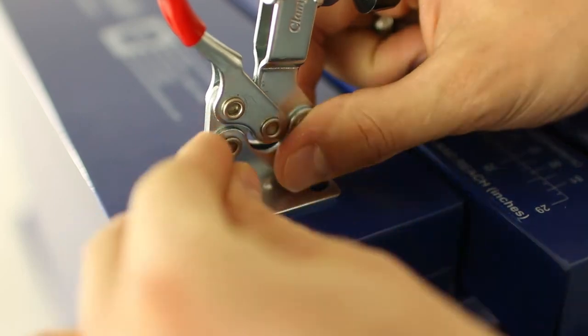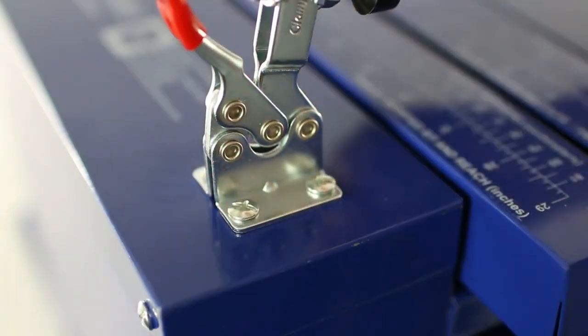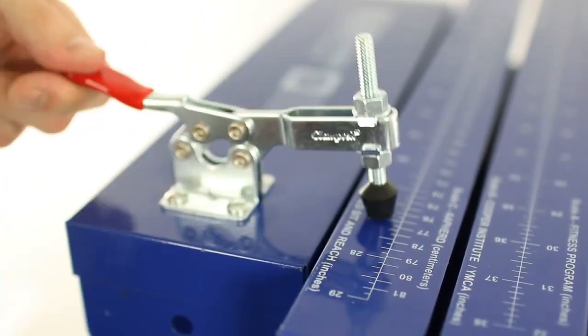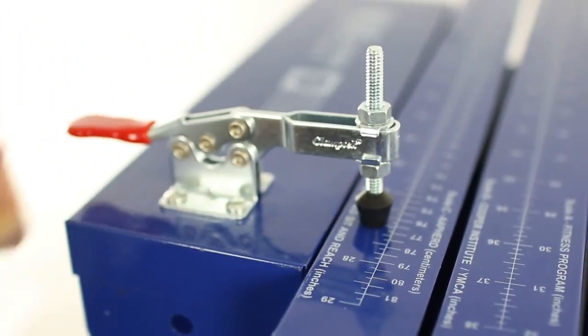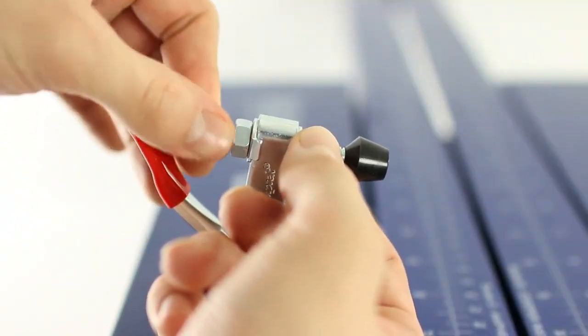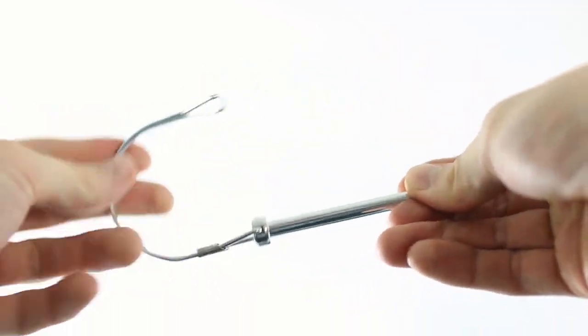Mount the stopper labeled G to the top plate on the holes provided. This stopper is used with the modified flexibility tester to hold the sliding top channel at one location. The nuts on the stopper may have to be adjusted for the stopper to touch the sliding top channel. Use the hitch pin to perform a standard test on the modified tester.